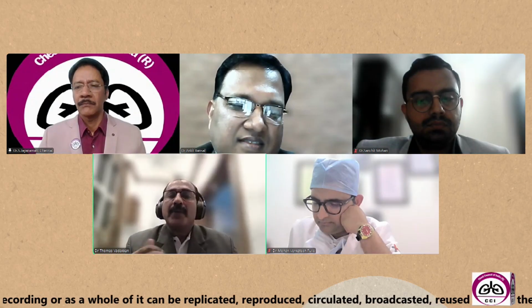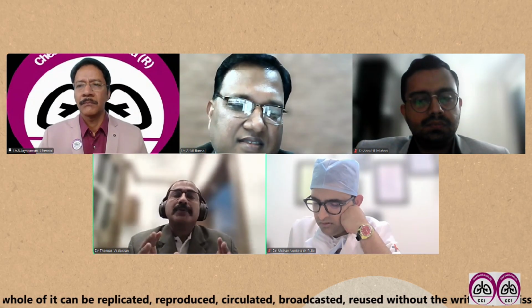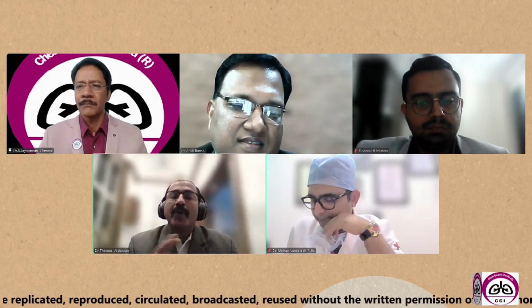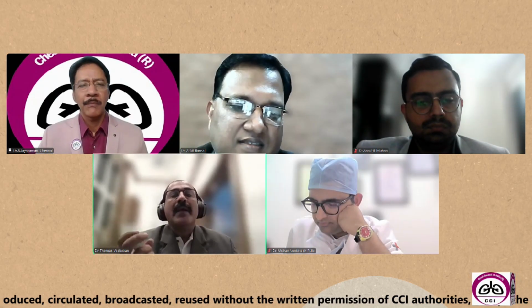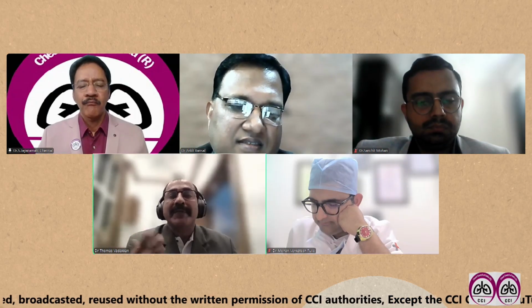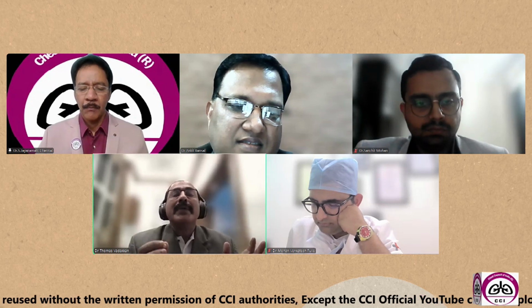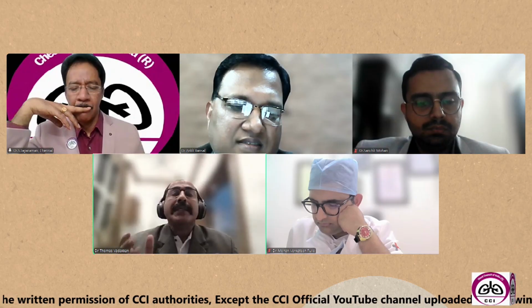And know the node, that is the second most important step, because we should do the Doppler. We should review the post-contrast images, so we get a rough idea of the vascularity of the node. And the Doppler will give you an idea about any intranodal vessels, also the vascular proximity to the node, and you can plan accordingly. Next important thing is know your needle.